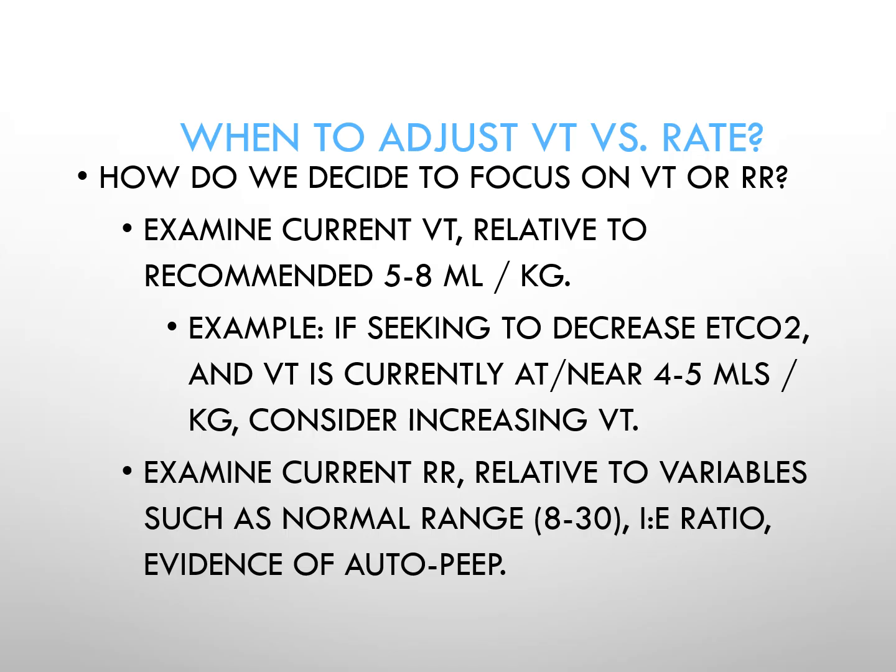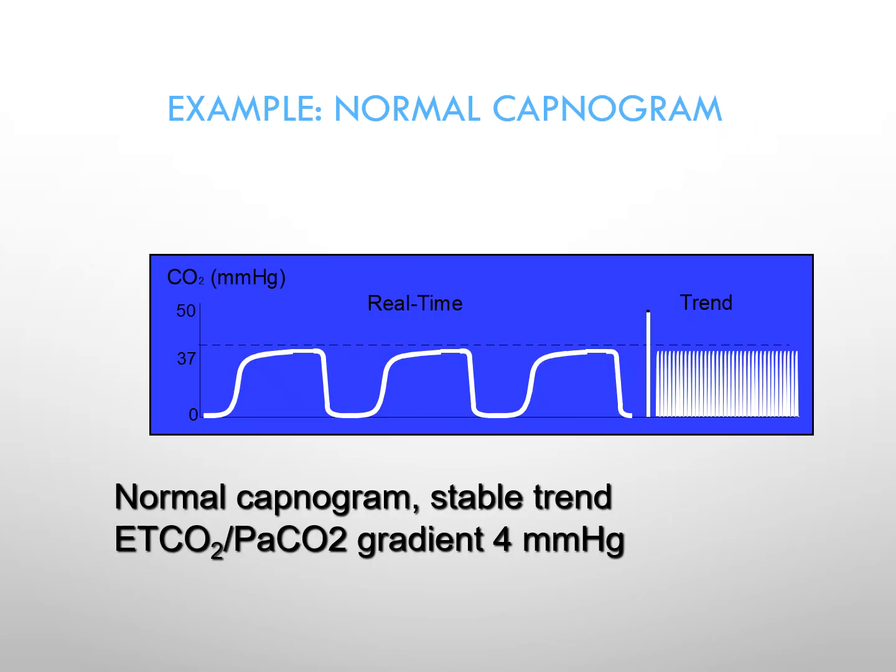So absent problems with IE ratio and auto-PEEP, if you're looking to decrease the end tidal CO2 and your respiratory rate is on the low end of the scale, increase your respiratory rate. So now let's look at the capnographs, or capnograms. Again, looking at the actual waveform.